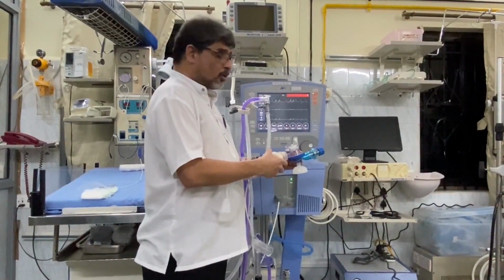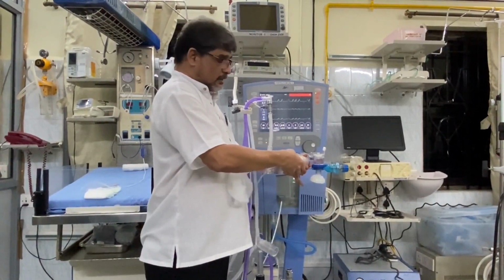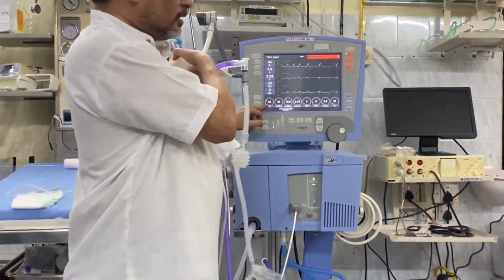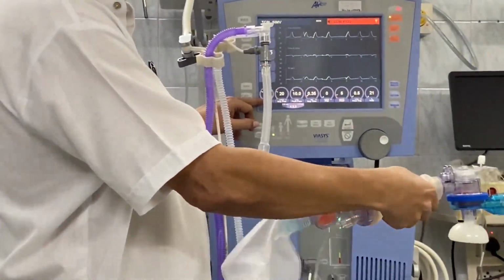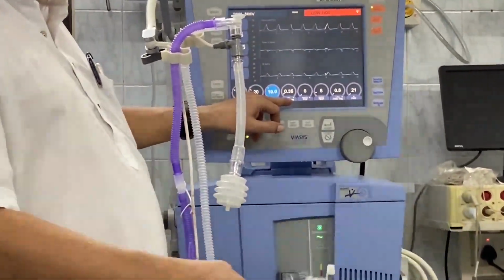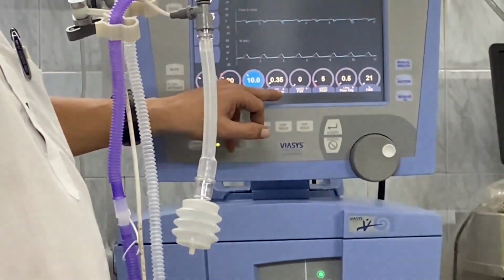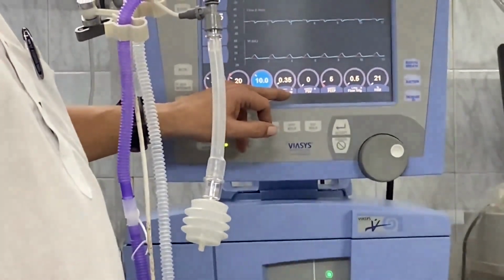Now let us see the analogy of this bag and mask to this ventilator. This per minute is the number of breaths, and this is exactly reflected here. You can see 40 here. This 40 is the respiratory rate, which I am giving the baby. Next comes inspiratory time. You can see the inspiratory time of 0.35 seconds. In adults, you give it from 0.75 to 1.5 seconds. In children, the respiratory rate is faster, so you keep the inspiratory time low.